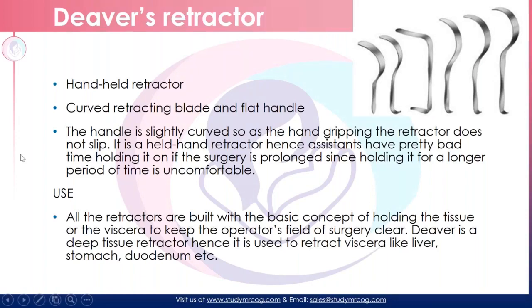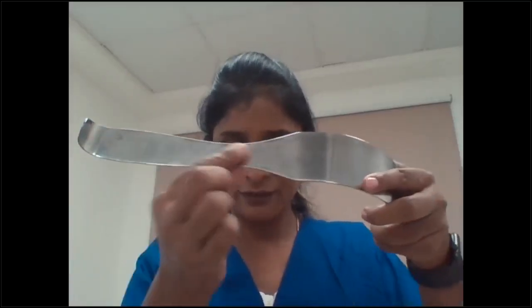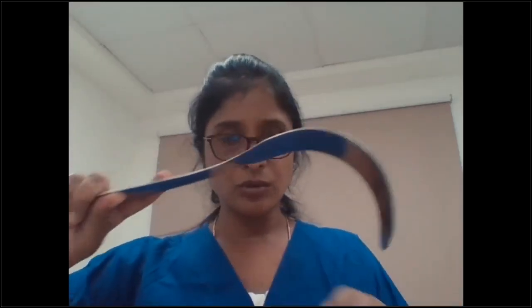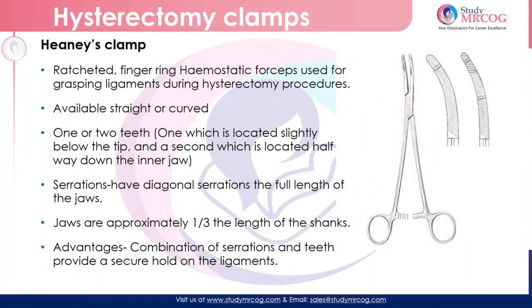Let me show you the Deaver retractor. So this is a Deaver retractor. As you see, it is a flat retractor. It has one curved end and the other is a flat handle — if you see, it's a flat handle. On the other end it is slightly curved just to have a grip on it. You would actually retract the organs to have a desired look at the field. This comes in different sizes, and what I have here is a smaller one. This is a Deaver retractor.